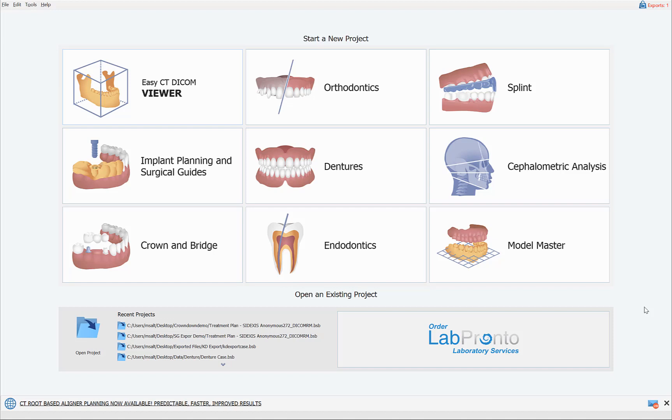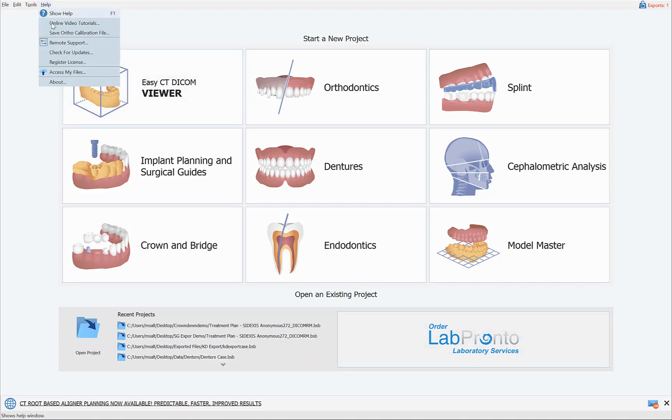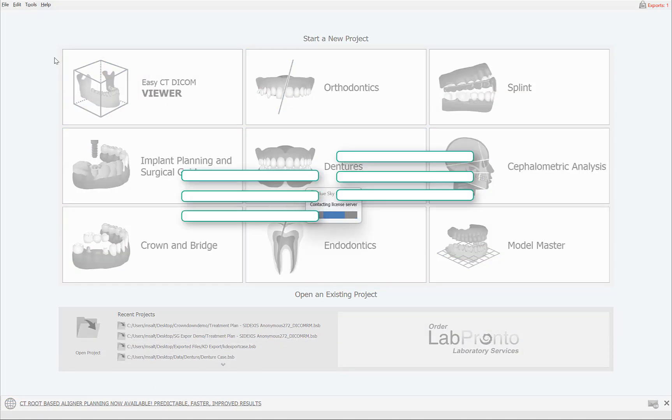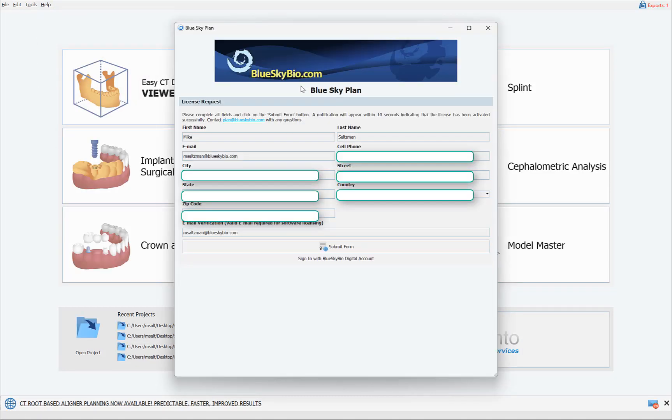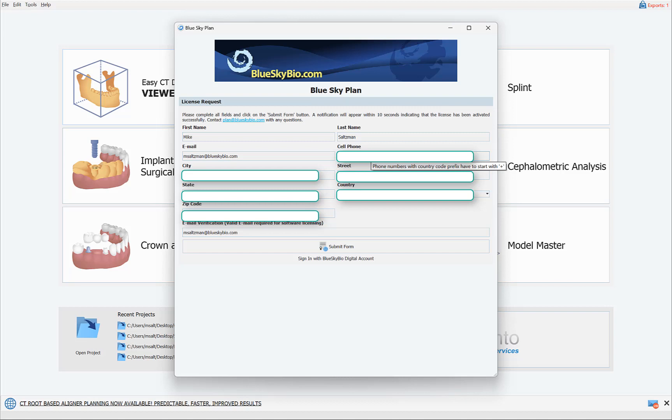So first of all, if you go to Help, Register License, we see the registration and login information for the particular computer with the relevant email and phone number. Now if you activate BlueSky Plan on multiple computers using the same email and phone number, then when any of those computers do an export it will be drawing from the same pool of export credits associated to your account, to your email and cell phone.